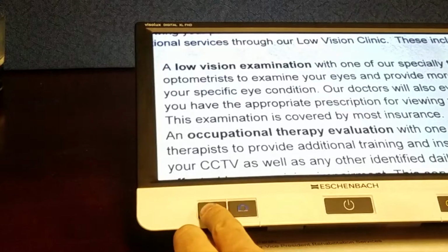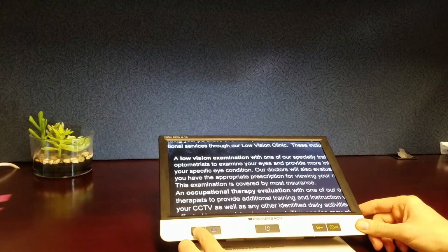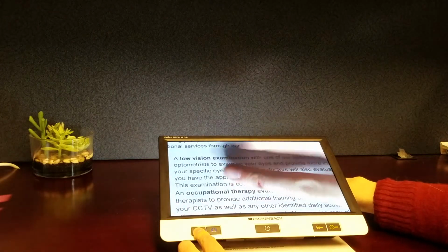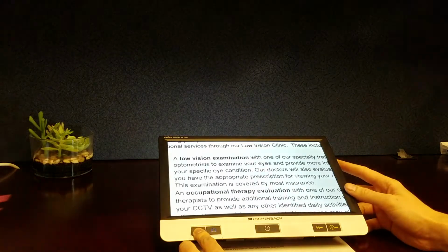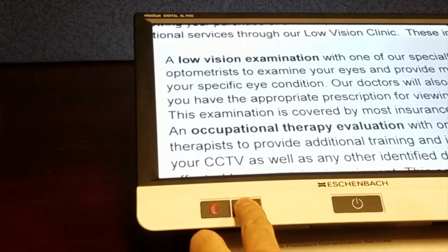We also have the color, which I'm going to show now. So press the color button. Here is a nice white on black. Here is regular color. Put my finger underneath there and hopefully we can see that that's in its regular color. And we also have the high contrast black text on a white background. Just over to the right, the contrast button, we have the button to take a picture.